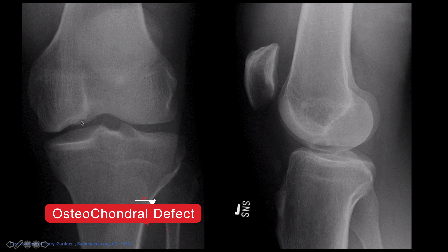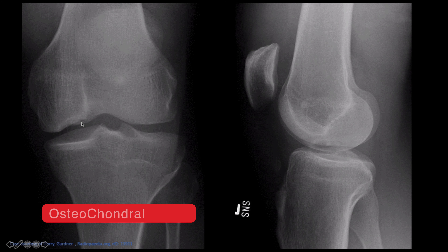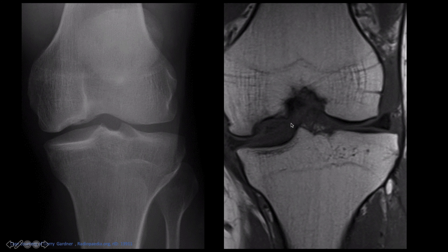The next case is an osteochondral defect. You can see on the AP view how there is a dip at the lateral aspect of the medial femoral condyle, from repetitive micro trauma. You can see that on the lateral view as well. When you look at the MRI, you can see it much better - this dip corresponds to an osteochondral defect.